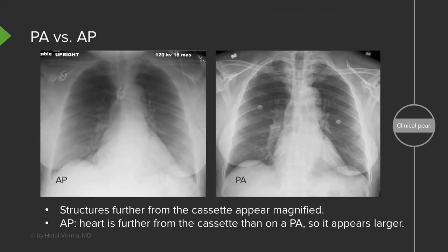The standard is always performed in the PA — not the AP. On the AP view, structures further from the cassette appear magnified. The heart, being furthest from the cassette or detector, appears larger on the AP view than on the PA view, so the PA gives a better anatomical representation. You can also see that on the AP view everything appears slightly hazy, while on the PA view structures are more clearly defined.